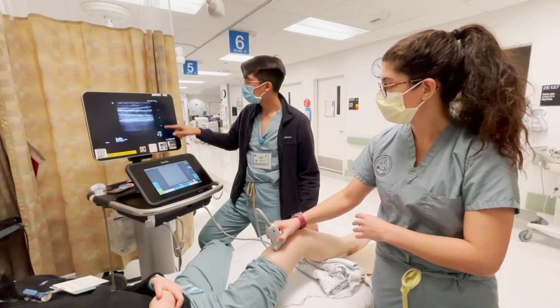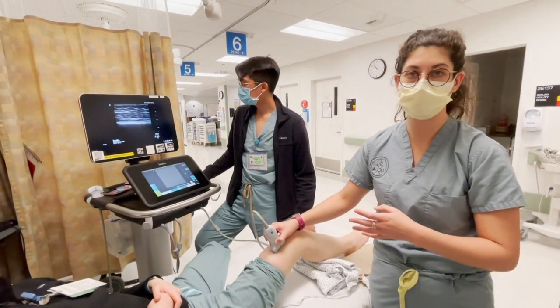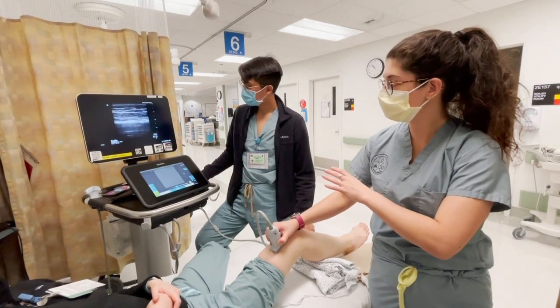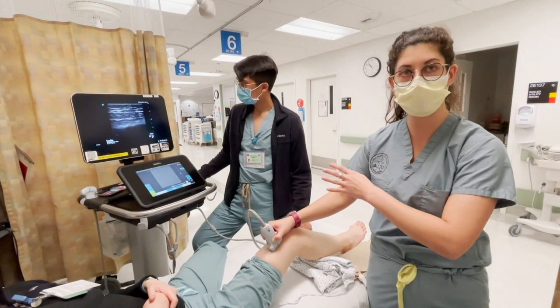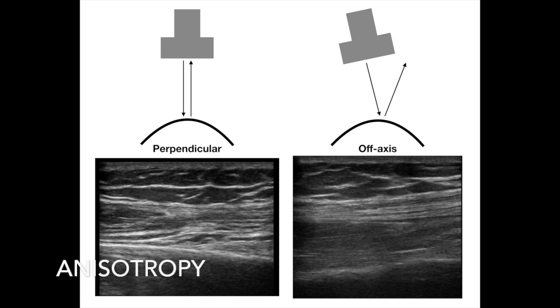Then we see the cortex of the bone. As we fan the probe back and forth, you can see how the bone exhibits anisotropy — it gets more sharp and in focus as you are more perpendicular to the bone, and more out of focus and fuzzy as you start to fan across it. When a sound wave hits an object in a perpendicular fashion, the echo comes back to the probe and you have a nice clear crisp image.